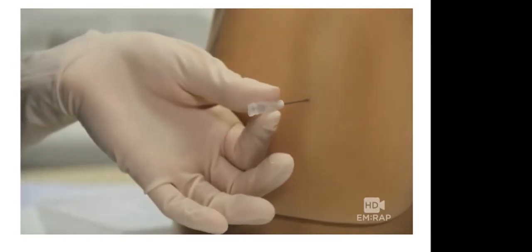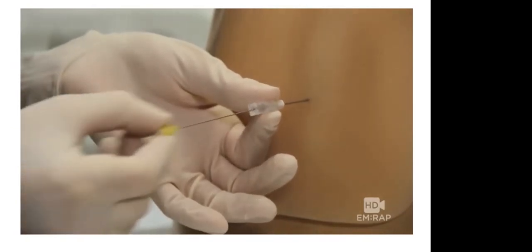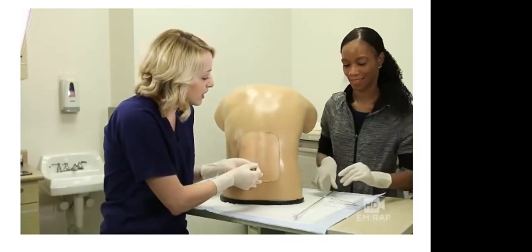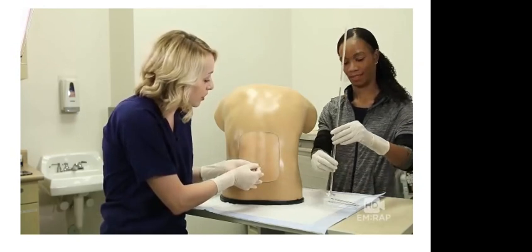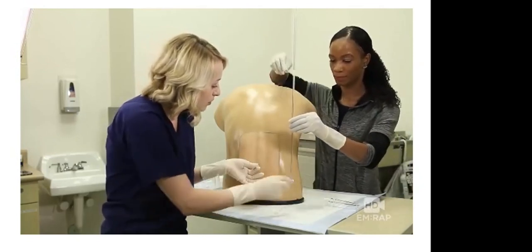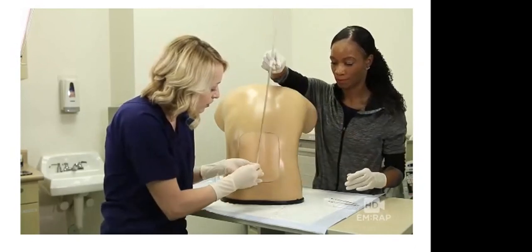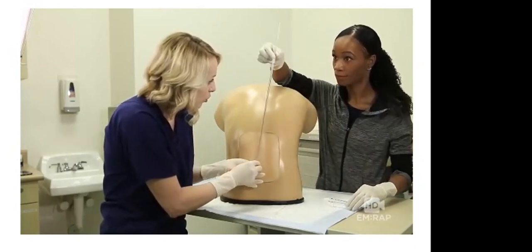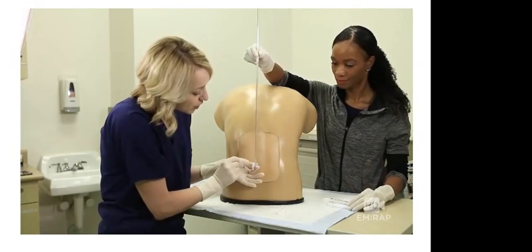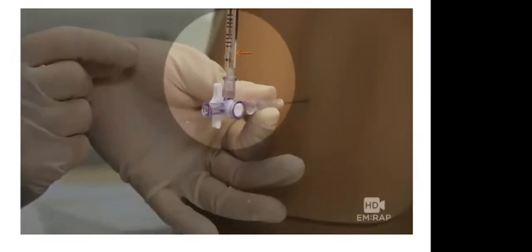And it looks like we're in right here. So I'm going to ask an assistant, Dr. Whitney Johnson, to come help me out at this point. If you wouldn't mind getting the manometer. And we will set this up right here. Would you hold the top for me? And you can see the fluid column starting to rise up the manometer to give us a pressure.